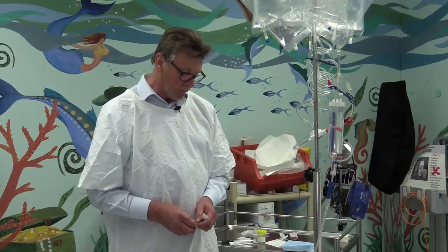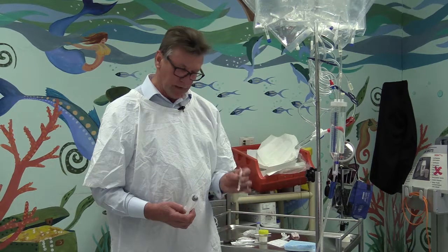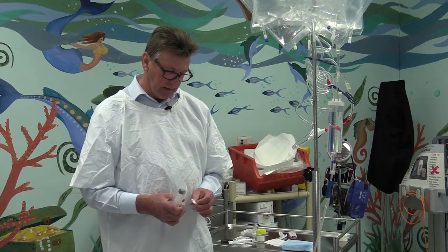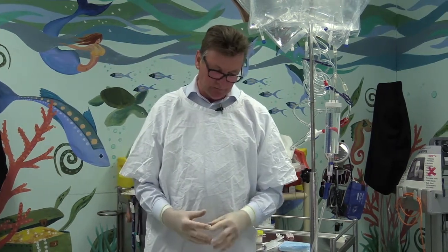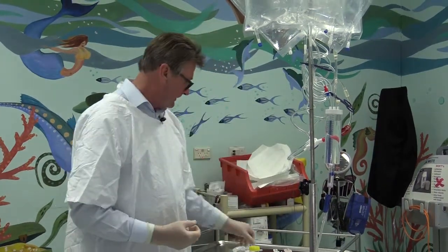To sample the fluid, we need to use a 20 ml syringe and a large bore needle, and we need to send that off to the laboratory using a no-touch technique. Since we're sampling a body fluid, it is advisable and mandatory rather to wear gloves.